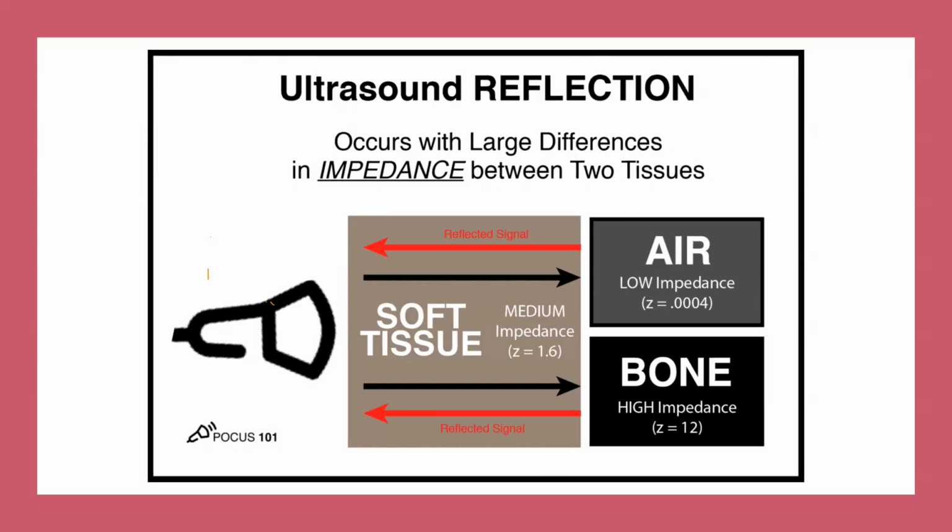So the meninges will give you very good reflection. On the other hand, as you go into tissue, at the interface between the meninges and tissue, again, there's a change in acoustic impedance there. So the superficial layers of the brain, if you're using a high frequency probe, will look very nice because there's a lot of reflection. The deeper areas will look less nice.